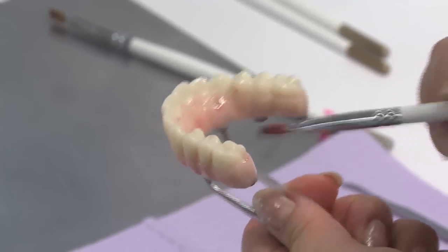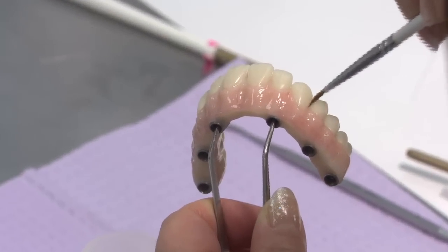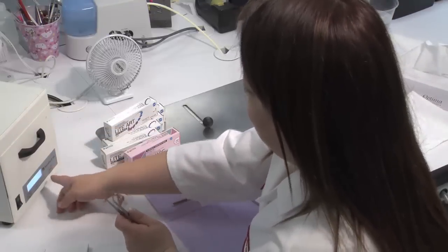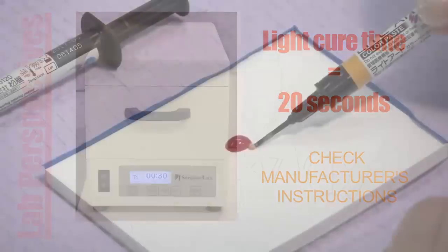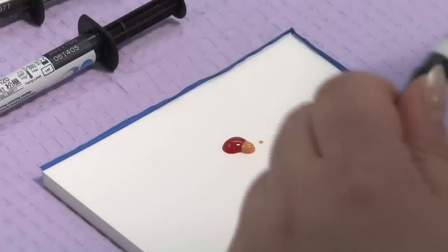Before the appliance is cured, check to make sure the papilla are cleaned up. Use acetone to remove any misplaced stain. Next, place the Ceramage stained appliance into the light curing unit to cure for approximately 20 seconds. The curing time depends on the type of light source you are using, so please follow the manufacturer's instructions for your specific equipment. Once curing is complete, dispense the Light Art stain and mix on a palette.